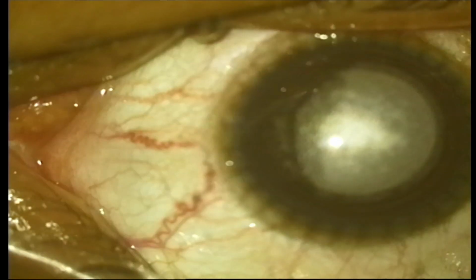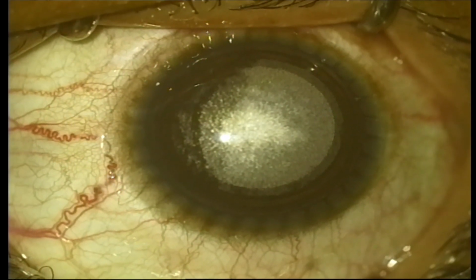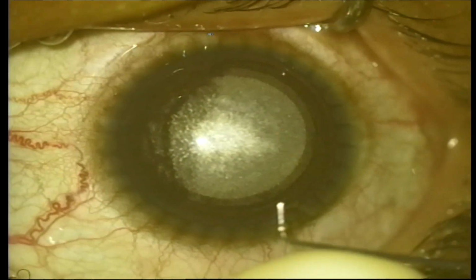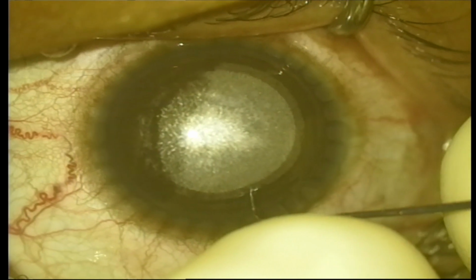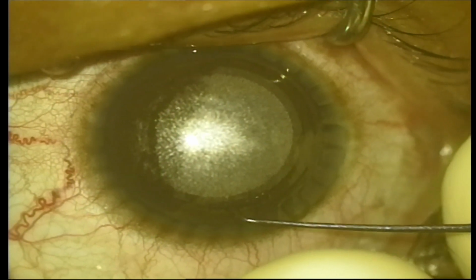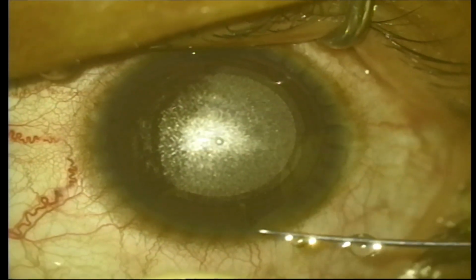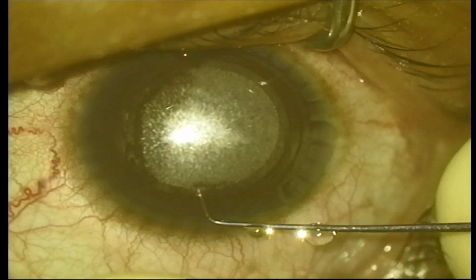Look straight, please. Can you see a diffuse light? Okay, give me that. So what I am going to use is essentially going into the entry cut. You see I am going into the entry cut. Now this is the movement. Put one drop. I have to just go up to go into the anterior plane. So this is anterior to the lenticule.